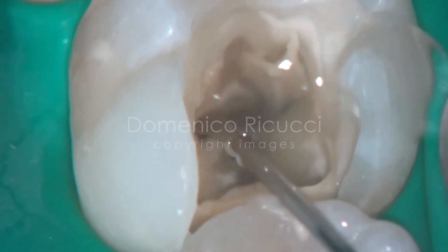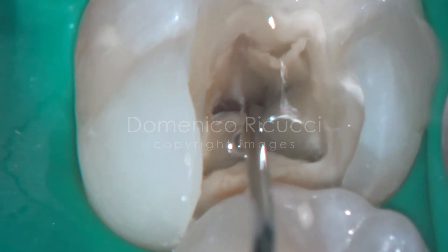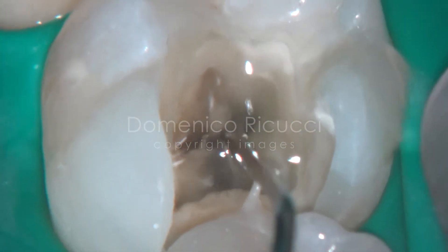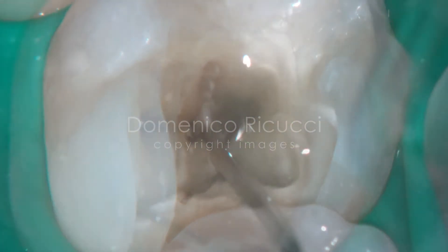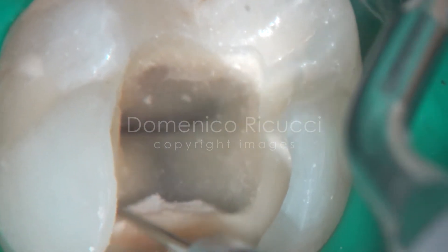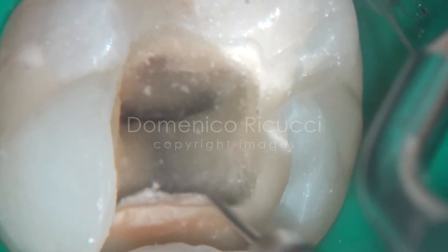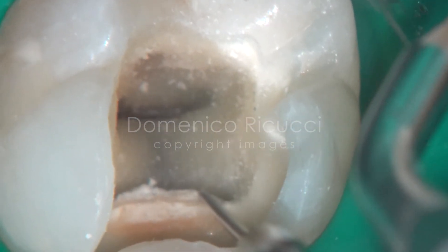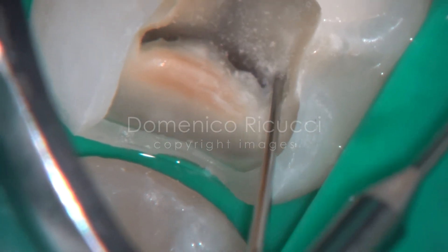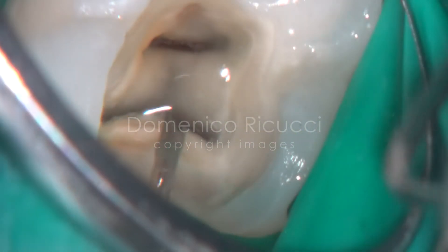Liquefaction necrosis appears in the pulp chamber. Irrigation with 1% sodium hypochlorite is performed. The dentin covering the mesial orifices is prepared with ultrasounds and the orifices enlarged with Gates Glidden burs.